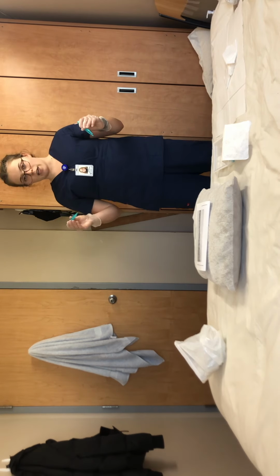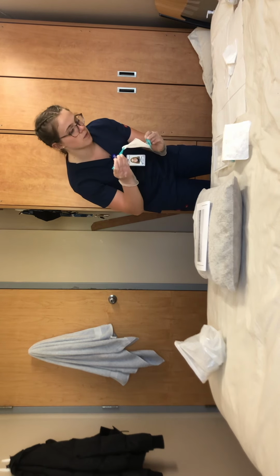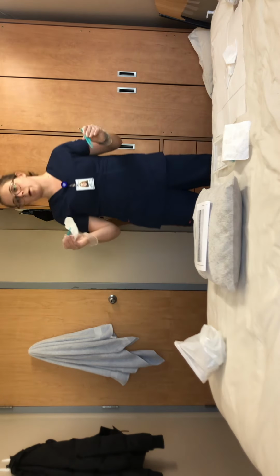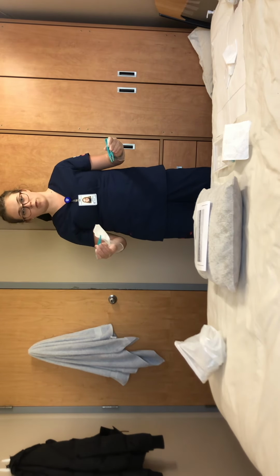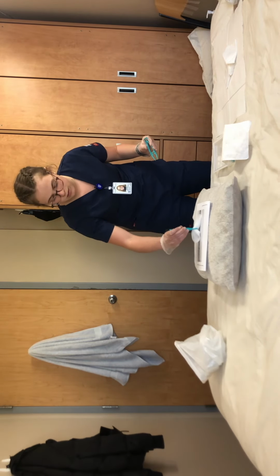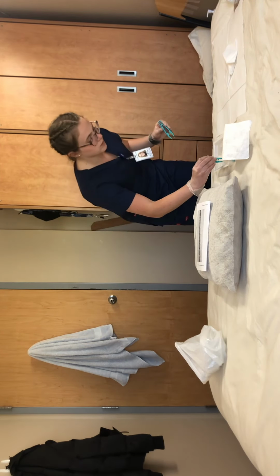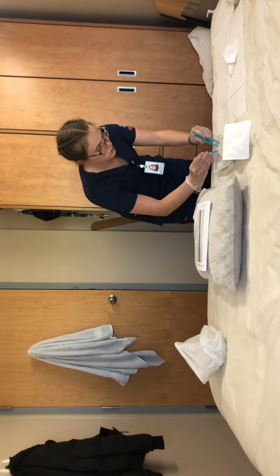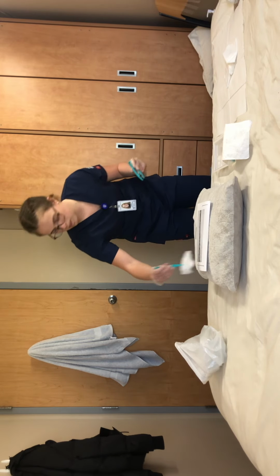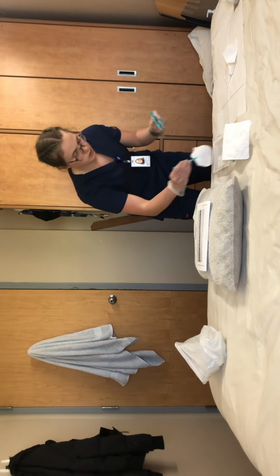Then I will be drying the wound as well, and I will be using gauze for this portion. Normally you would be using gauze for the whole thing, except because cotton balls are more likely to fall apart. But just for the sake of the video and the lack of supplies, I will just be performing it with cotton balls. So now I'll be drying the inside of the wound, starting at the middle. Then I'll be drying the peri wound. And then the dry peri wound.